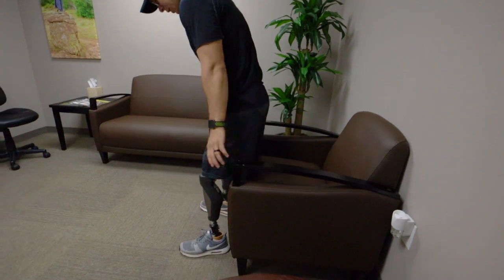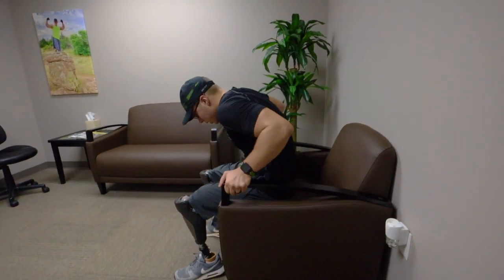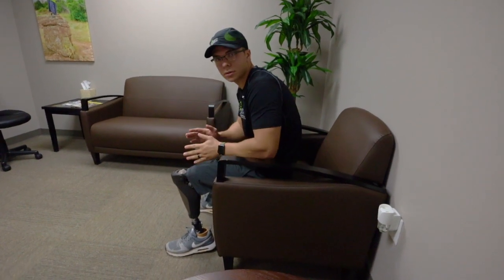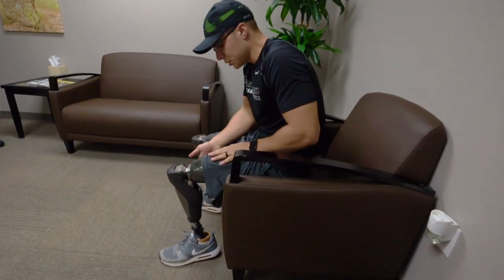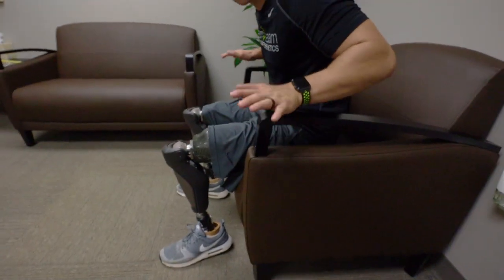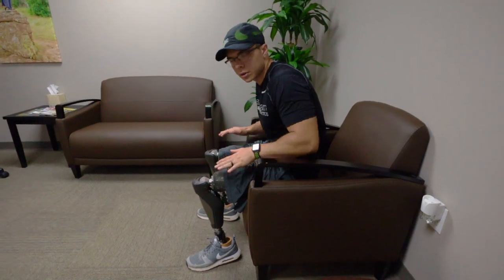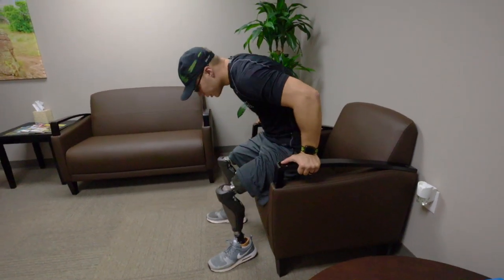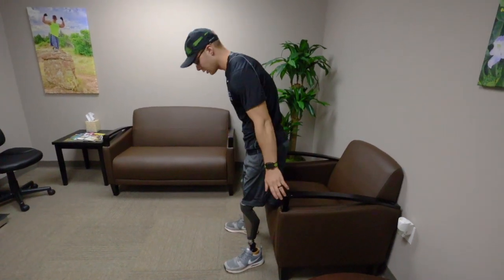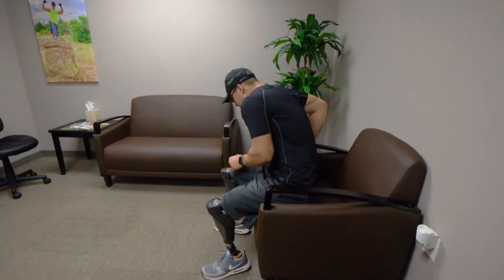Here is a regular chair with little handles, and these are good especially if you're just starting out building up strength. You can put both hands on the arms of the chair and just lower yourself down. The biggest part to focus on is using as much of your muscles as you can, so although you're still using your arms, you want to focus on trying to use your leg muscles still, so that you're still building up muscle and strength in your legs.